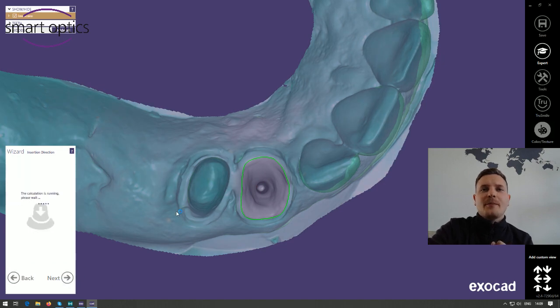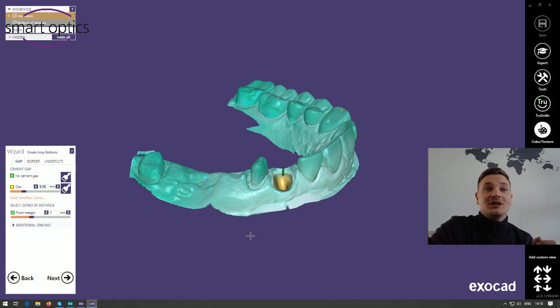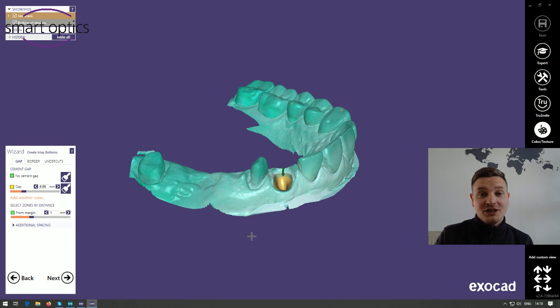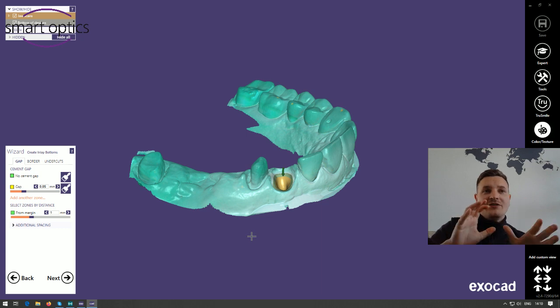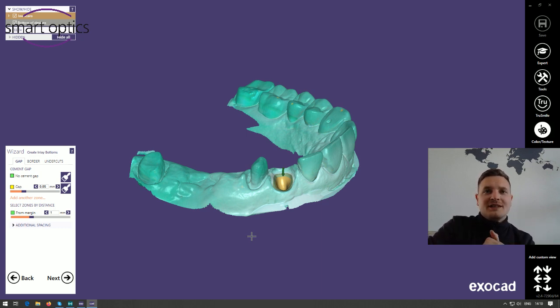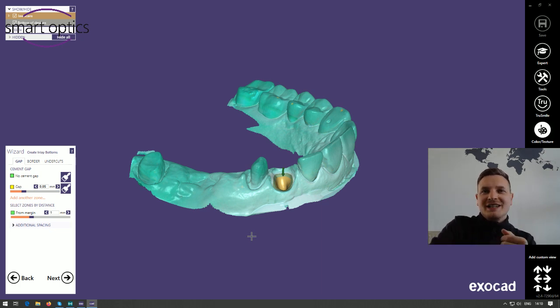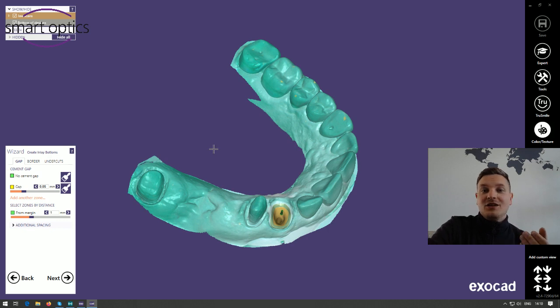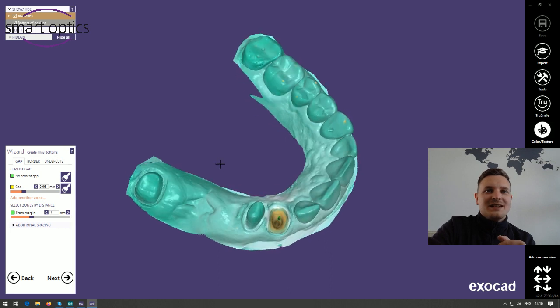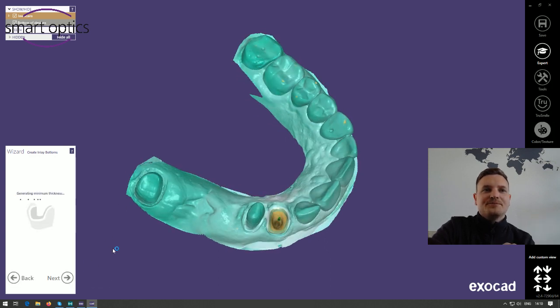The inlay bottom settings depend on your milling machine and the milling center you work with, so I'll leave all parameters on default. It's not possible for me to recommend specific ones — please ask your milling center, or you already know the right parameters yourself. I'll skip this step. ExoCAD will now create the tooth.